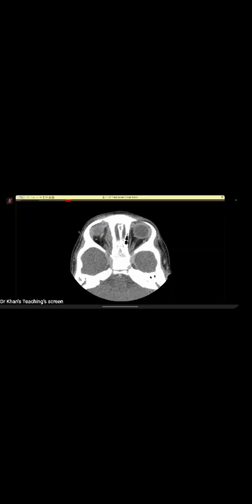Next candidate. Yes, good evening. Good evening. So this one is a 17-month-old baby, fever, headache, very unwell patient, red eye. Over to you. Okay, I am requesting the control. Yes.